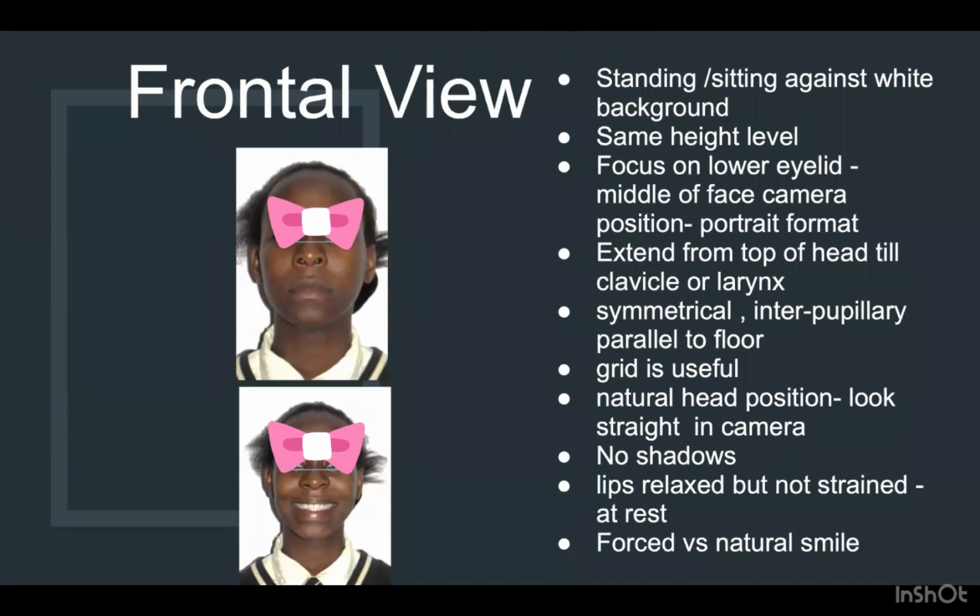There should be no shadows. If you see here, you can see a shadow here. And this is not acceptable. Here you can see a shadow. I should have placed the patient against another wall and tried the same picture, okay? The lips should be relaxed, not strained at rest. There should be a natural smile, not a forced smile.